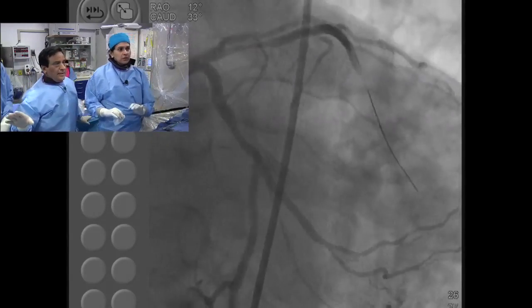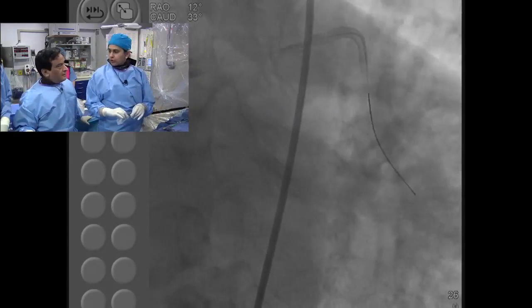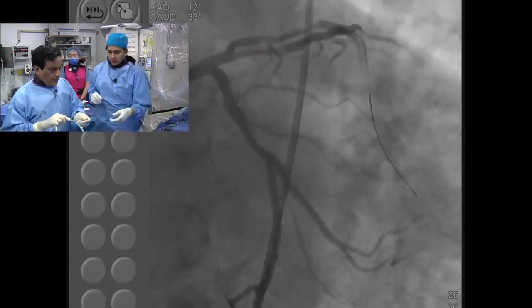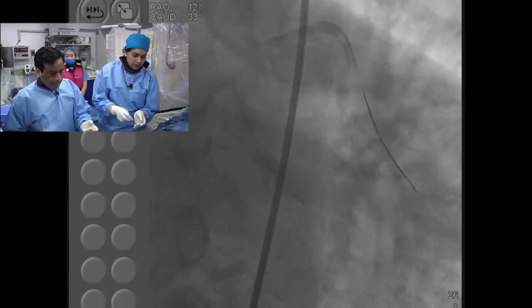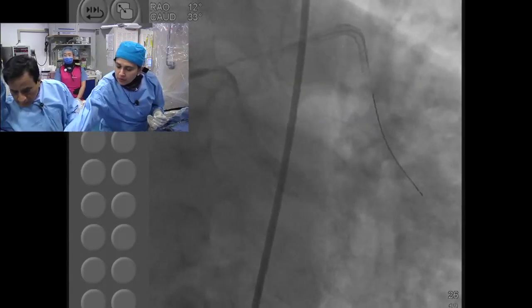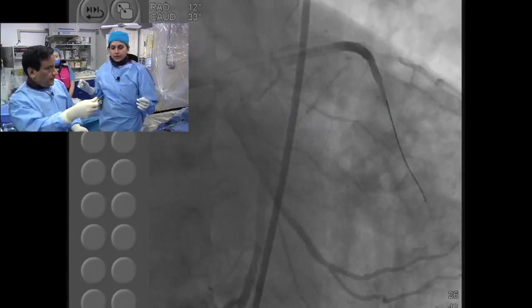Because once you open this major LAD. This is such a beautiful view to Grand Slam. No, I'm telling you, it will change. No, go with the Runthrough here. Go with the Runthrough wire side by side. Yeah, you already opened it. On the other hand, the wire is looking in a good position, straightforward.